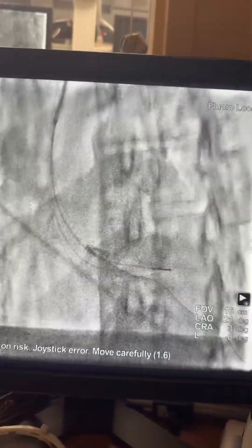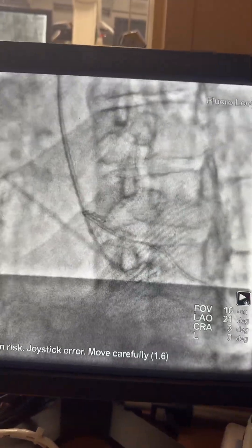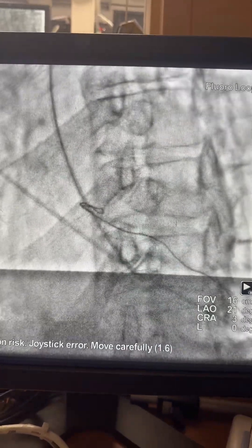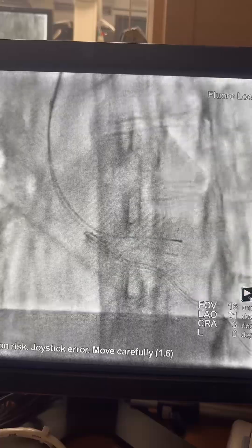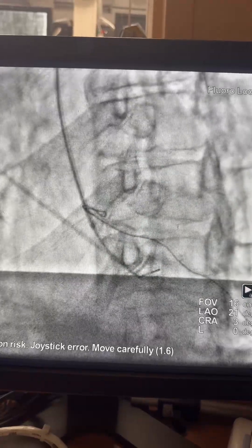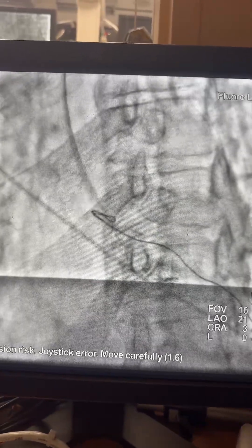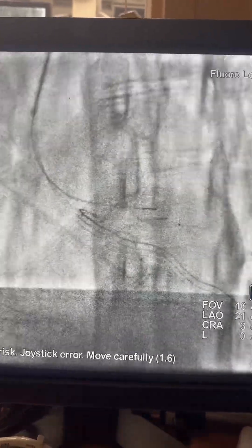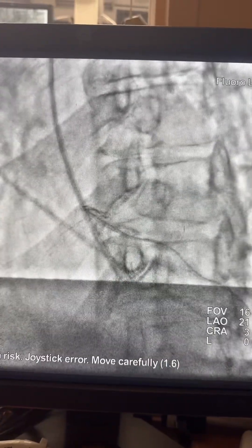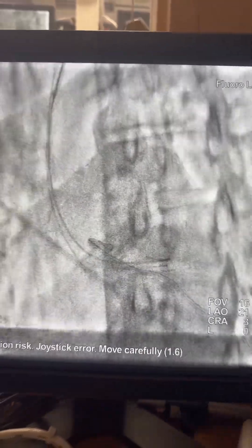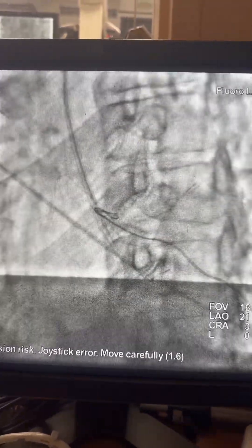I had to use the woolly wire to advance toward the heart and do the angiogram, which revealed multi-vessel disease. I'm not going to review that — we'll just go to the peripheral findings. At the end, I had to direct the catheter toward the abdominal aorta.